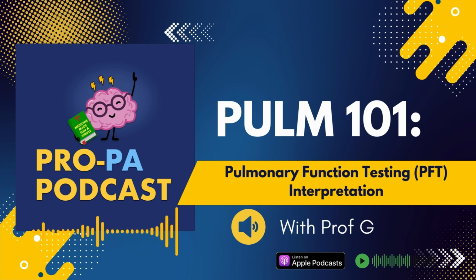Step 1. Examine the FEV1 to FVC ratio. This is going to be your first step to determine if there is an obstructive defect. A normal FEV1 to FVC should be greater than or equal to 70%, or greater than or equal to the lower limit of normal based on age, gender, height, and race.